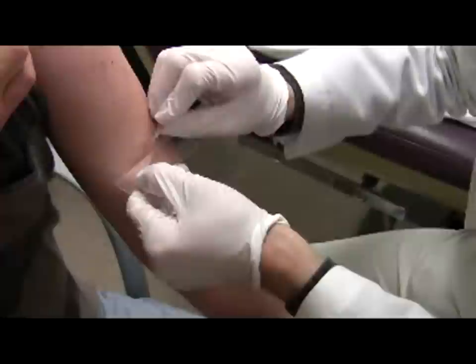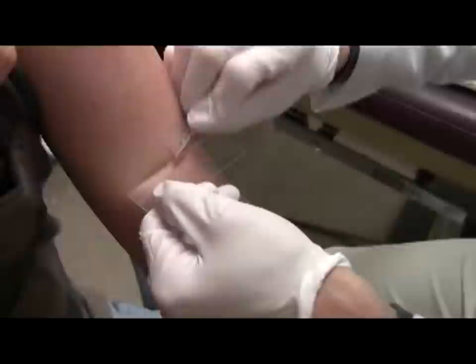So here you see there's scale, and I'm just gently rubbing, and a lot of scale is coming off, and that's great.